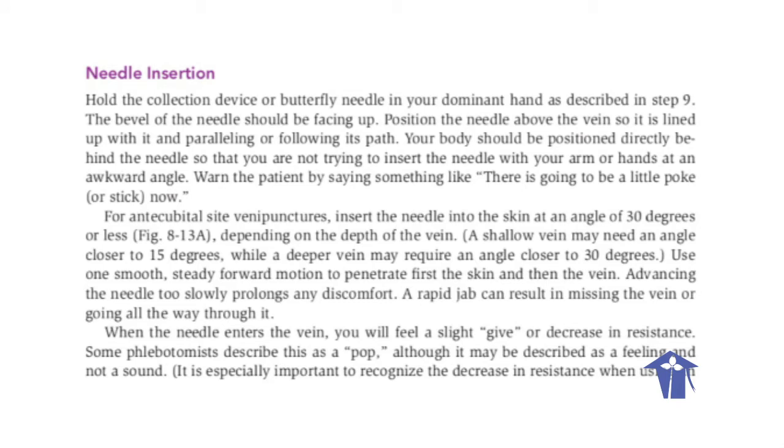Needle insertion. Hold the collection device in your dominant hand as described in step 9. The bevel of the needle should be facing up. Position the needle above the vein so it is lined up with it, parallel or following its path. Your body should be positioned directly behind the needle so that you are not trying to insert the needle with your arm or hands at an awkward angle. Warn the patient by saying something like, "There is going to be a little poke or stick now."